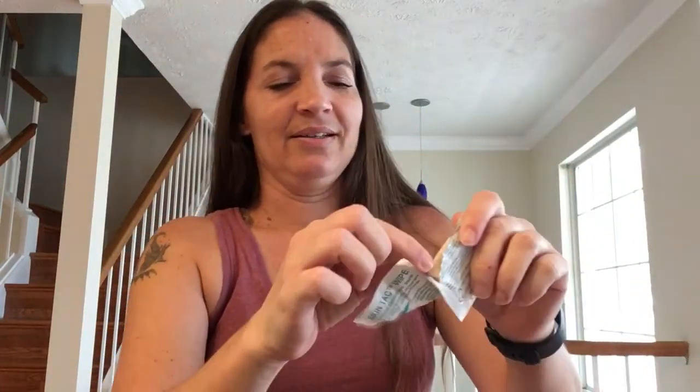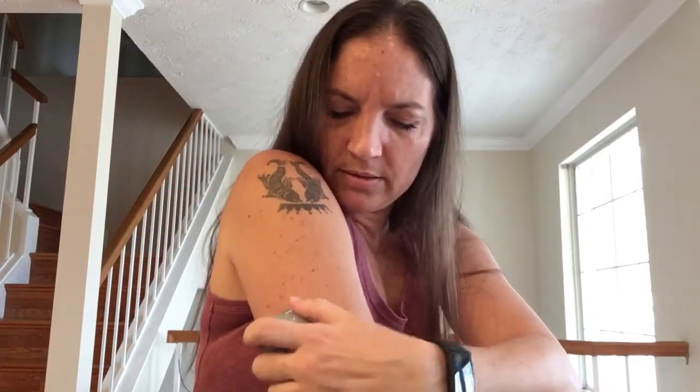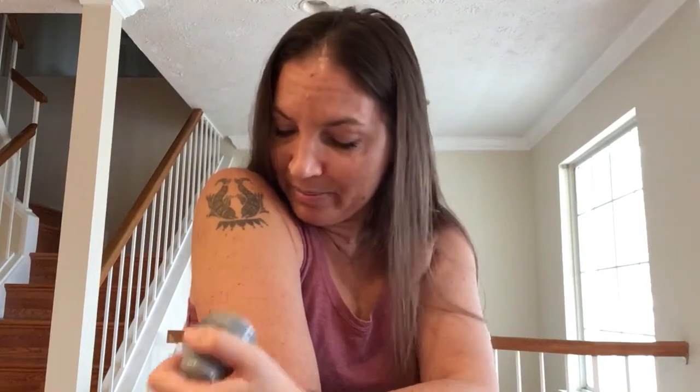Get my skin tack. Okay. And let it dry for a second. And then we'll just see what happens when I scan. I don't know why I make such a big deal out of going to the right side of my body, but somewhere in my mind, the right side's gonna hurt. So, whatever. And I have my theories, but not enough time to explain them.